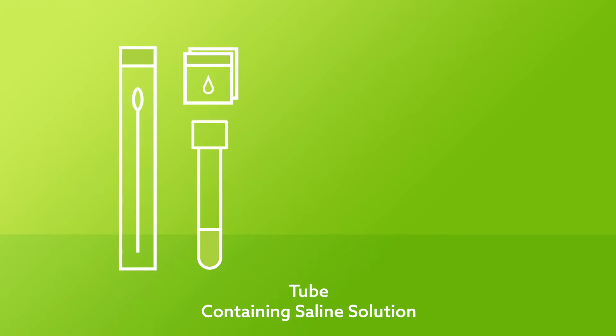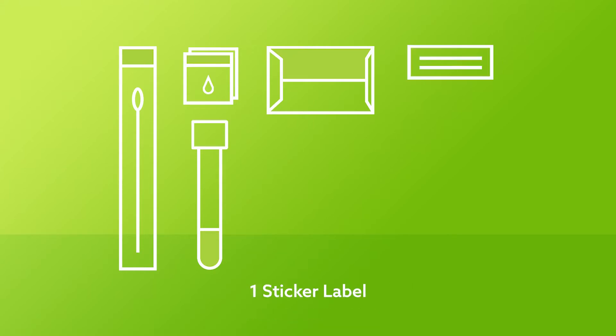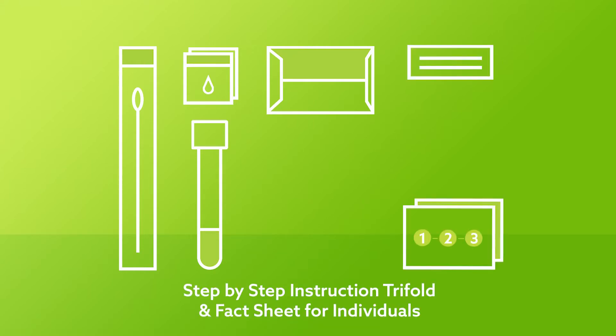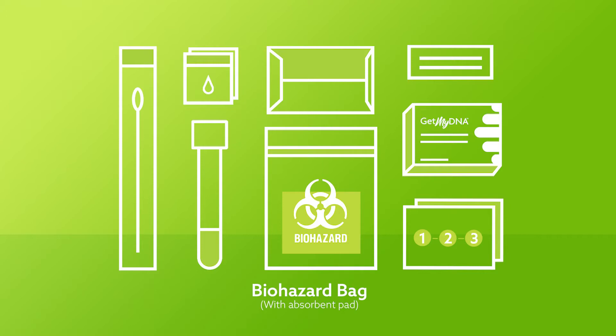It is important that you do not spill this solution. A pre-addressed and prepaid return envelope, one tube label, a step-by-step instruction trifold, a return box which is the same box your kit came in, and a biohazard bag with an absorbent pad.